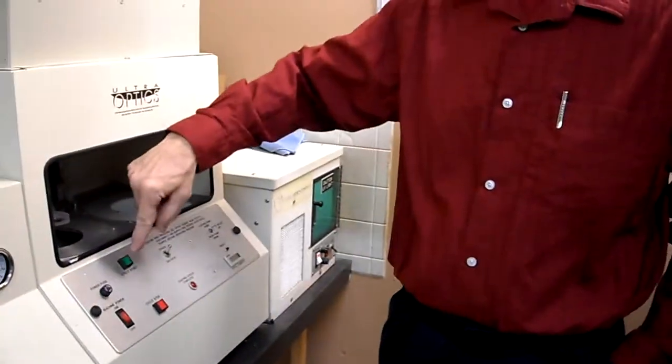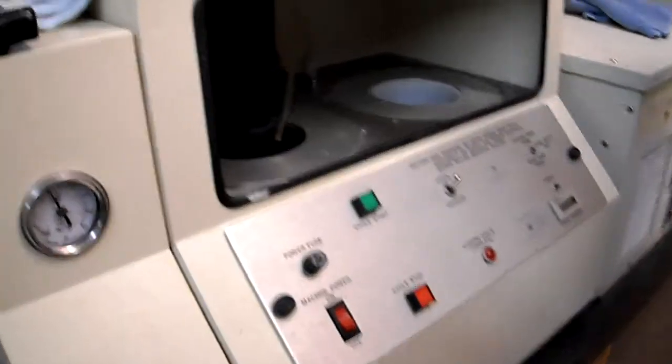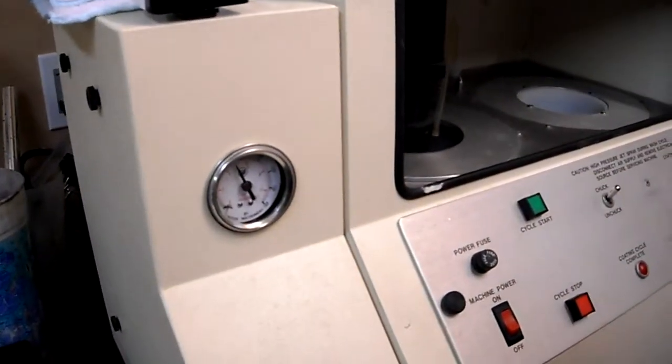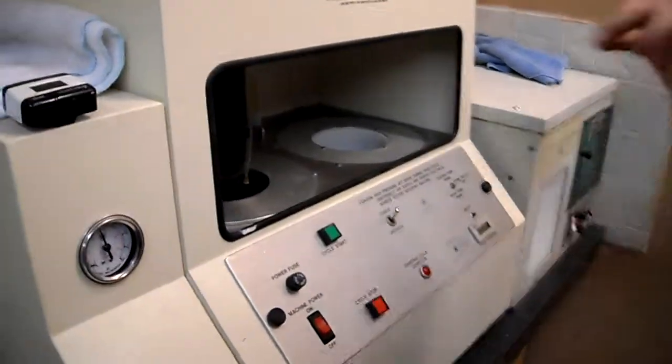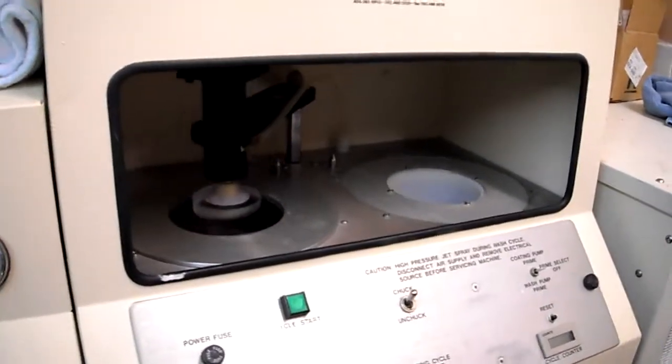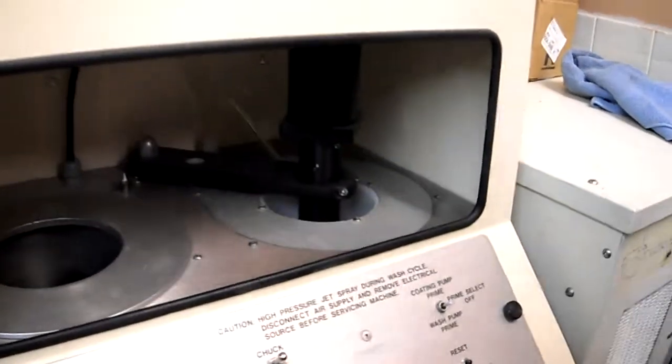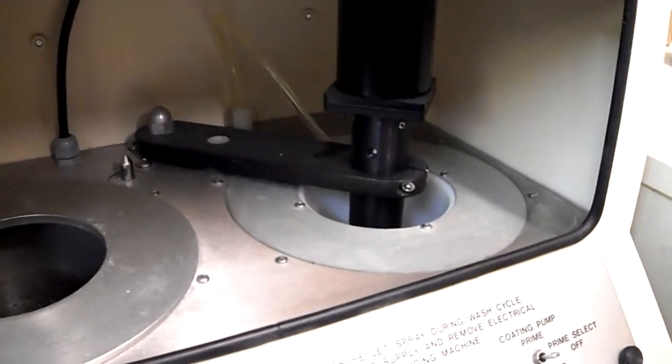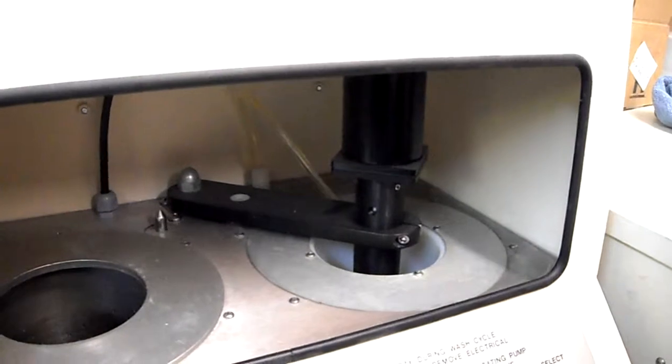I'm going to hit Cycle Start. The machine washes the lens, then it spins the lens. It comes over here and coats the lens, then spins the lens again.